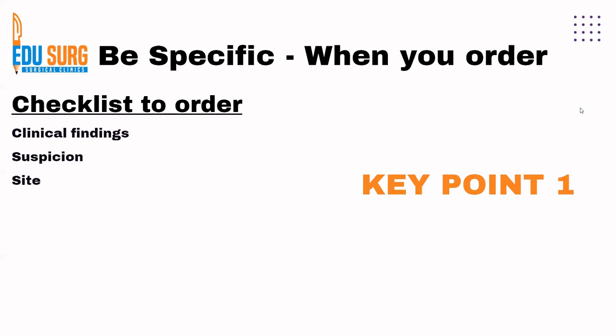So when you order a scan, it is very important that you specify that you are suspecting, say, an acute appendicitis or a small bowel intestinal obstruction, because in obstruction the contrast is different. They can't give 2 liters of contrast in a patient with small bowel obstruction, right? So based on your clinical findings, the suspicion and the site of pathology that you are thinking of, the radiologist will then decide what all things need to be considered from the radiology point of view.